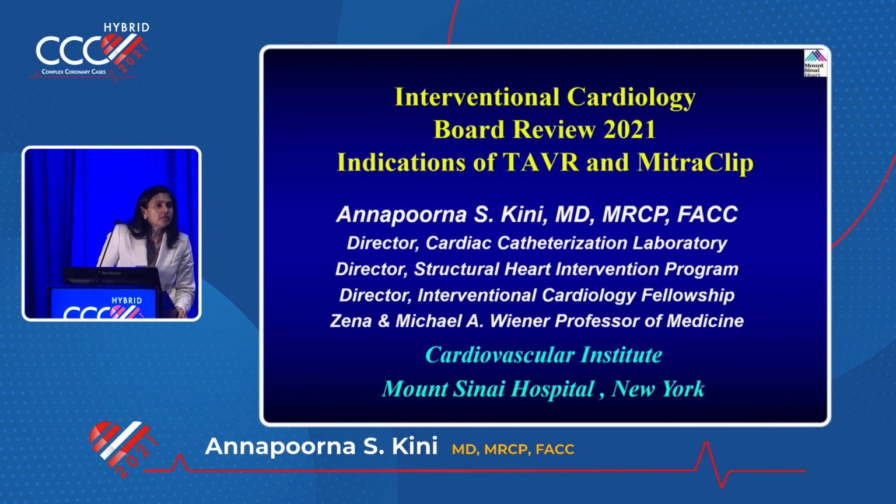Other mentioned, asking us more about engagement in post-TAVR catheter. I'm not sure, but it could be. You have an app for that. We have a paper and we have the app, right? But if you want to select one catheter, Amplatz would be the good one that you can use on both sides. But remember, aorta is now filled with this new cage.